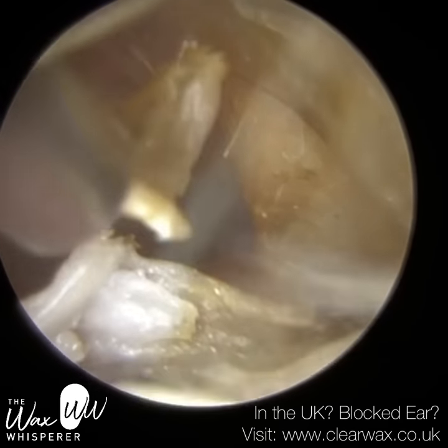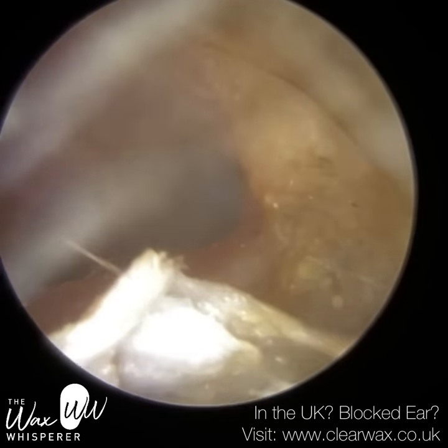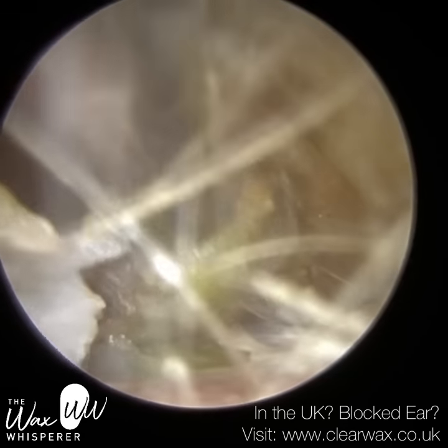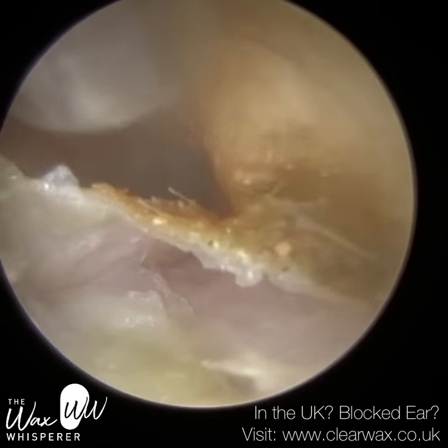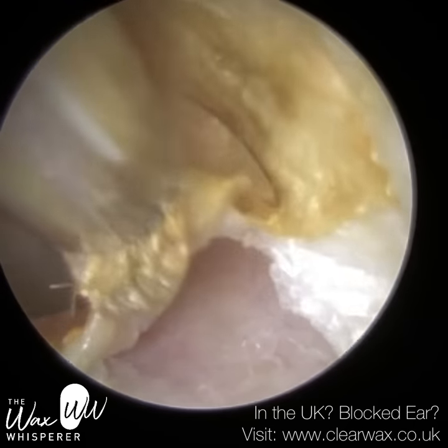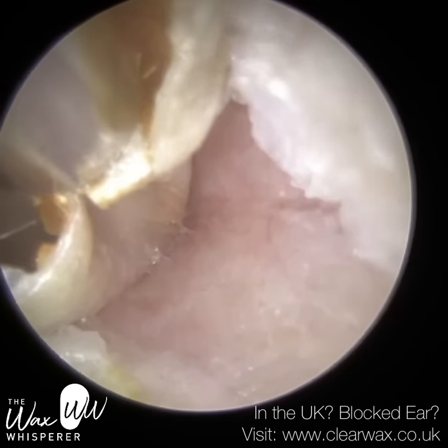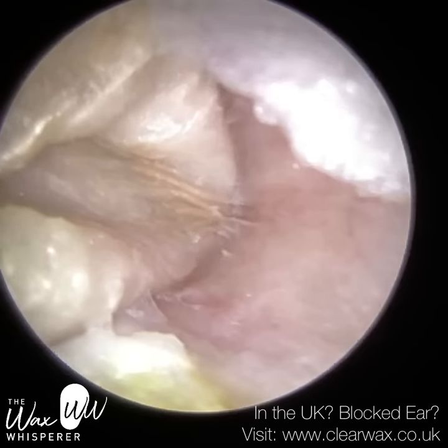So what I'm trying to do now is remove this thick layer of skin. One of the giveaways is when you visualise the eardrum — the eardrum has become very wrinkly, and again that's due to the maceration of skin. That's the giveaway sign for me when I examine someone's ears. If the eardrum looks wrinkly, then I know they've been exposed to excess water.